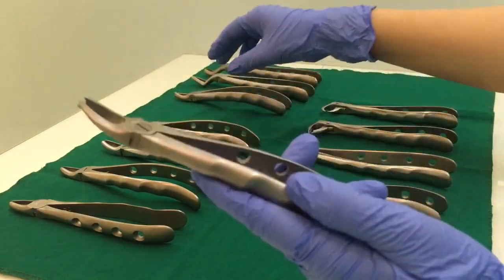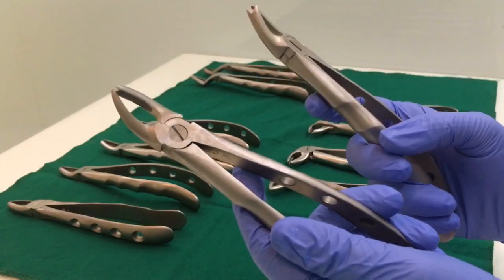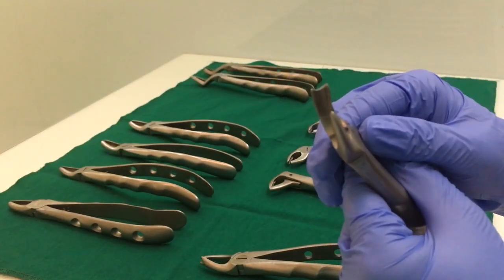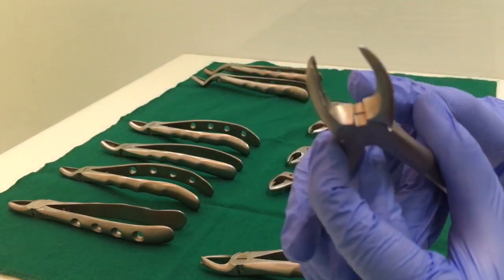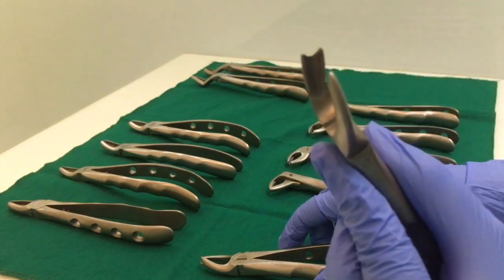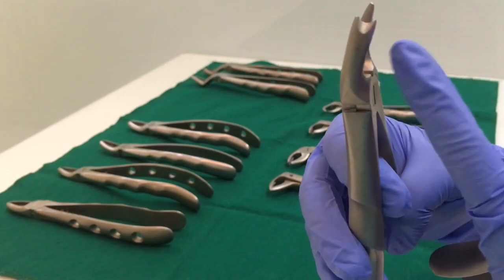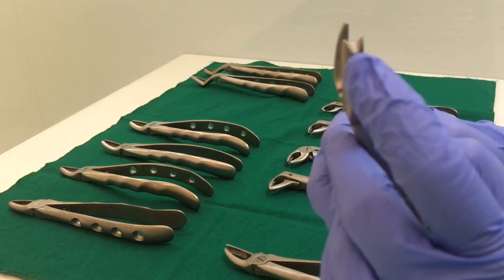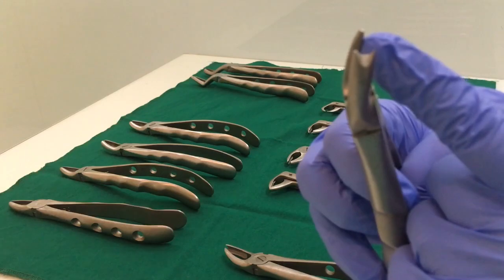Similarly, we have a set of upper cowhorn forceps as well — two of them, one for the right side and one for the left. The upper cowhorn forcep will have two ends: one is a single conical point, and the other is a bifid beak — there are two horns. The bifid beak is going to hold the palatal root of your upper molar, and the single conical pointed beak is going to engage in the furcation area of your buccal roots.